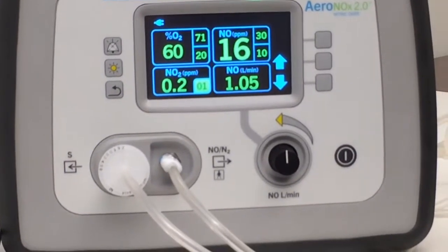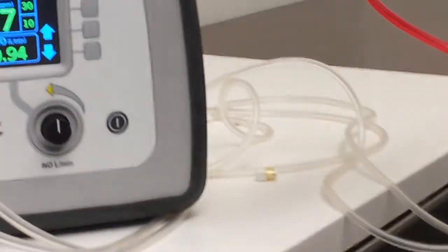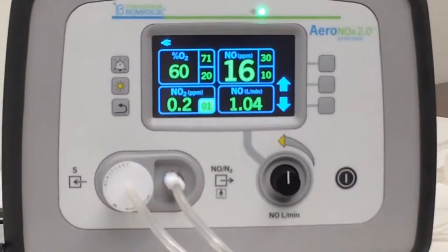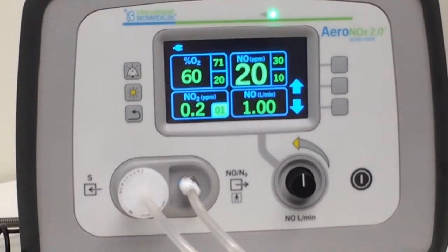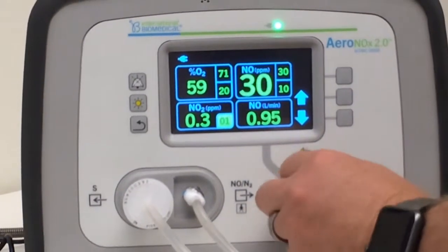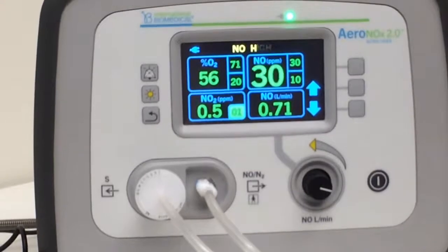One other important thing to know: any changes you make to the vent — since all of this is flow-controlled — if you make a change to your amplitude, you're going to have to go back and recheck your settings on the Aranox. That's just the nature of the vent. So if we go down a little lower on our amplitude, we see our NO number going up. Therefore we'd have to decrease our liter flow to get that back down to the 20 parts per million that we want.